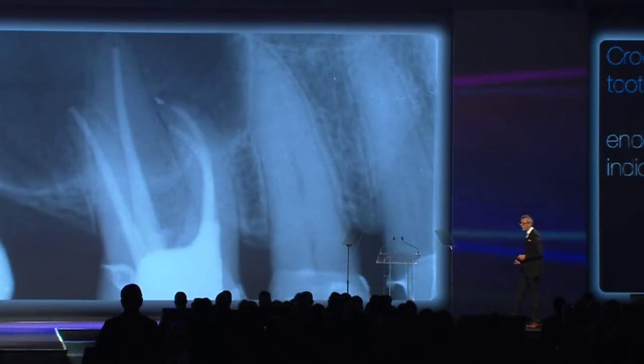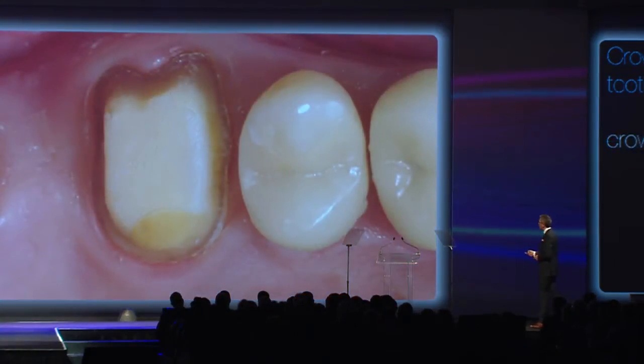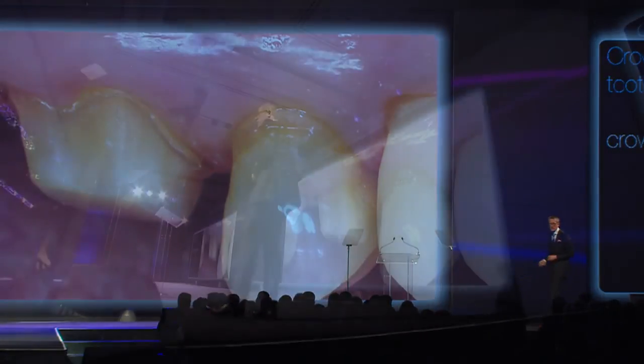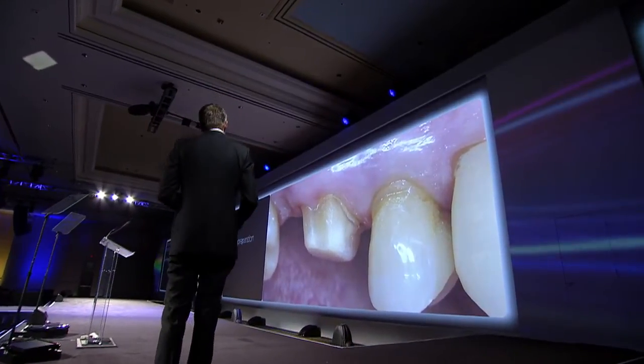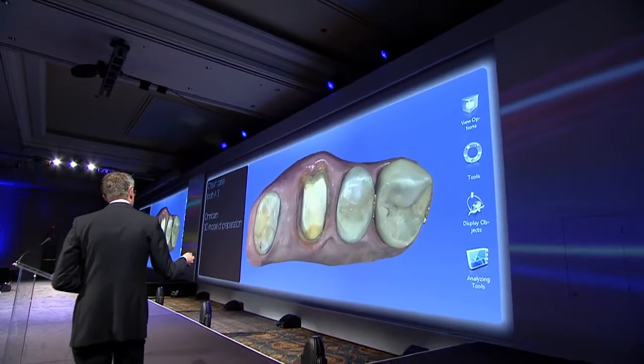Another case, a crown case, so this endodontically treated tooth here, and there was an indication for a crown. So again, I used in this case the OmniCam. This is after the preparation, easy preparation in this kind, supragingival. It's not a butt margin here, it's more a chamfer preparation, but that as well is easy for the OmniCam camera. The 3D model generated by the software here.